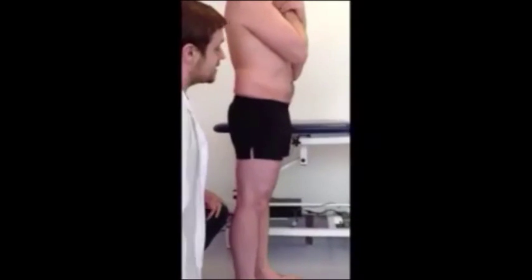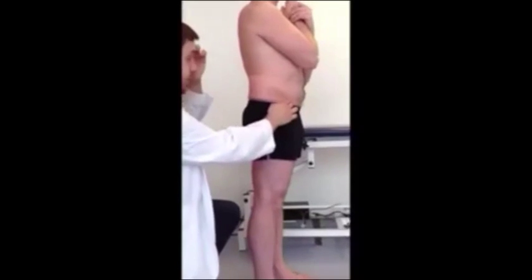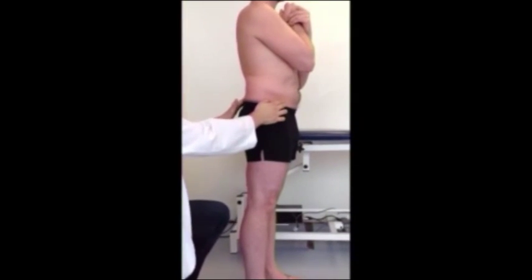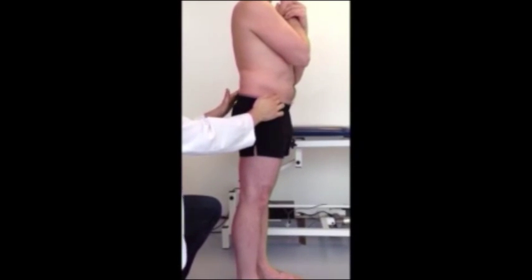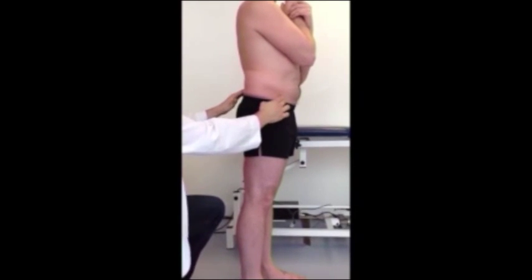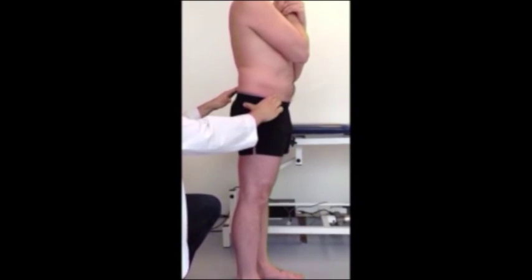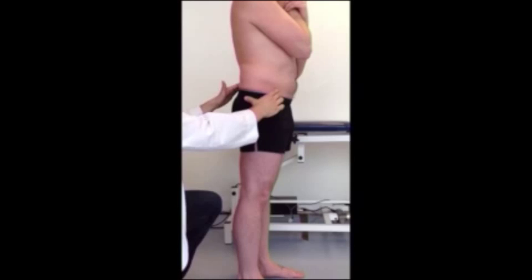Alright, the next structures I'm going to look for are the ASIS and the PSIS. The ASIS is the bony structure poking out at the front of the hip bone, and the PSIS is the bony structure poking out at the back of the hip bone. And there they are. And these 2 points are going to be reference for where the stationary arm of the goniometer bisects.